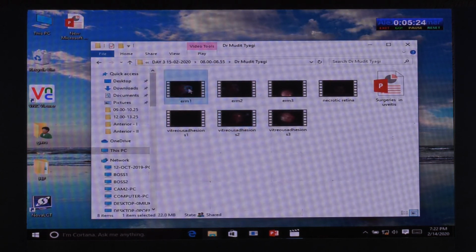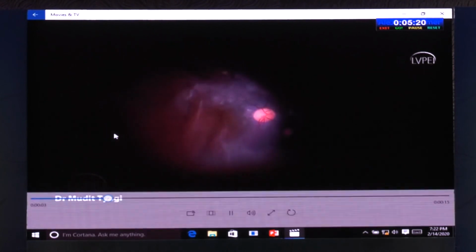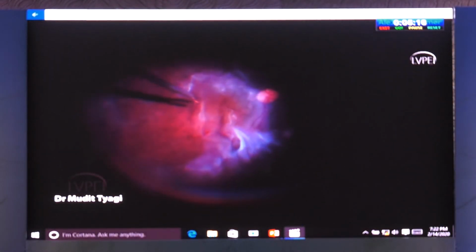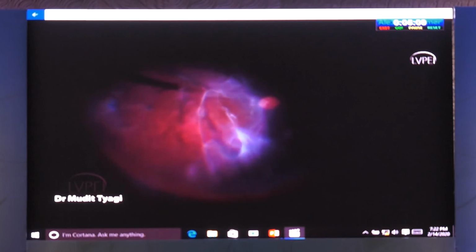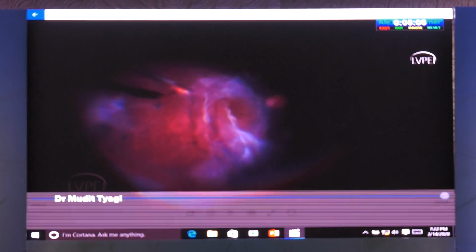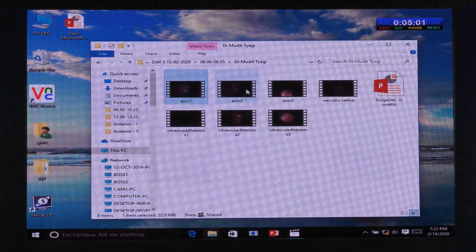It's probably got to do with more interleukin expression over here. The ERMs are also extremely thickly adherent, and if you're not very careful, you'll end up causing a break. So you have to be very careful in removing these ERMs. Some of the ERMs, specifically in eyes with acute retinal necrosis, post CMV retinitis, even in eyes with toxo we have seen, can be very thickly adherent, and you have to carefully remove them. Sometimes you might even need to truncate these ERMs. You can use a scissor or a forceps to remove them.